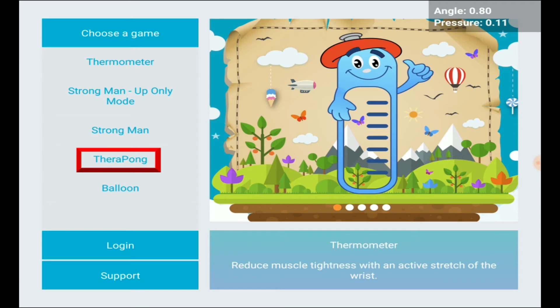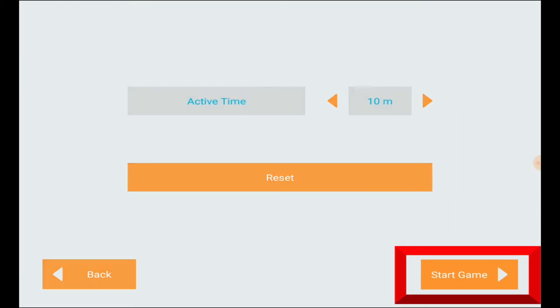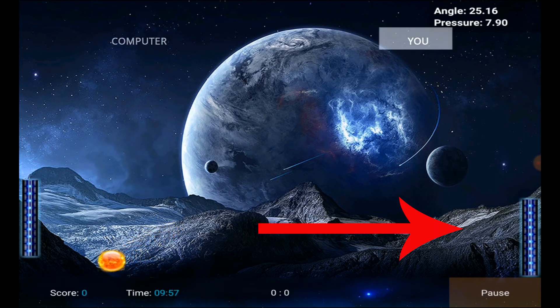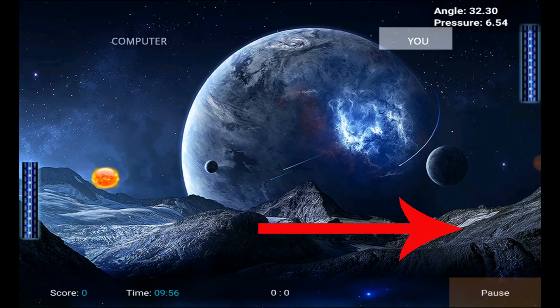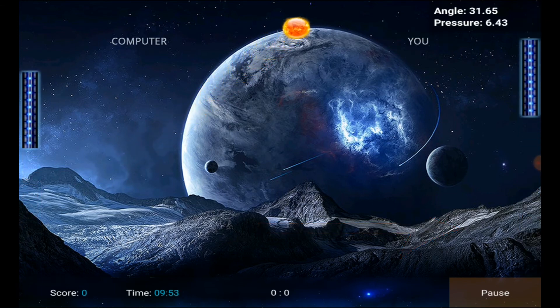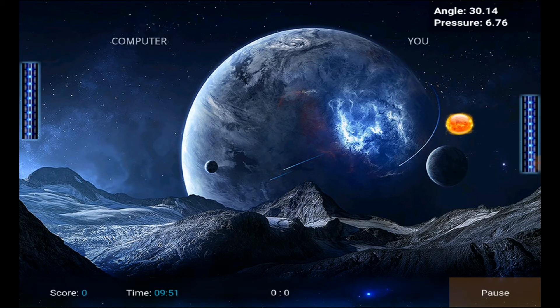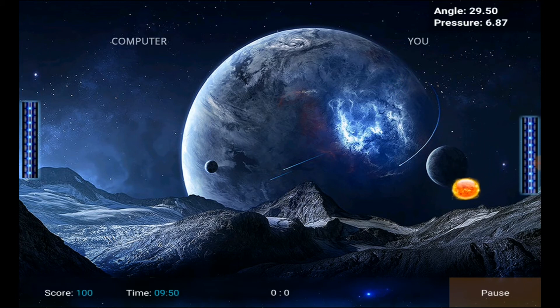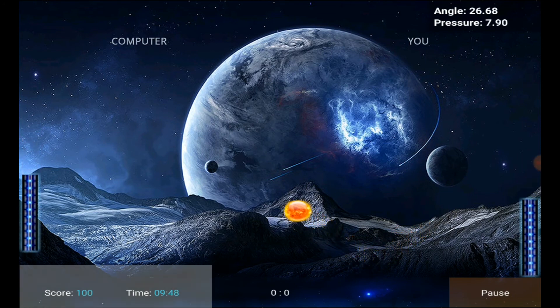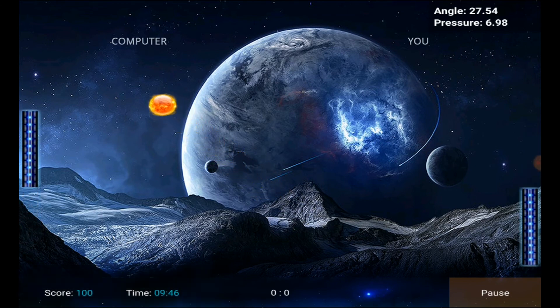Next, we're going to play the TheraPong game. Select TheraPong and hit next and start game on the bottom right. In this game, you'll be the paddle on the right side. As you move up and down, your paddle will move accordingly. You'll be playing against a computer opponent on the left side, and your goal is to prevent the ball from getting past you. The score and time are displayed on the bottom. To resume the next volley after scoring, simply move your hand up or down.